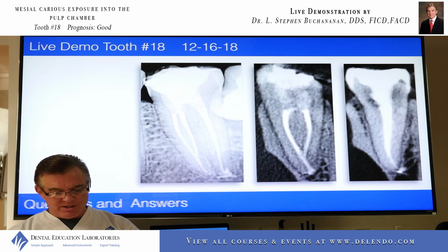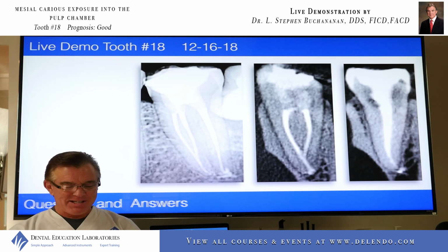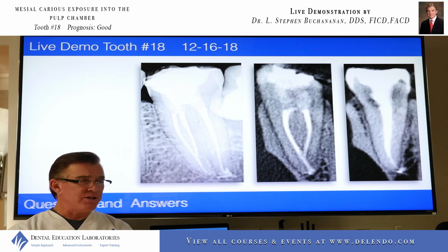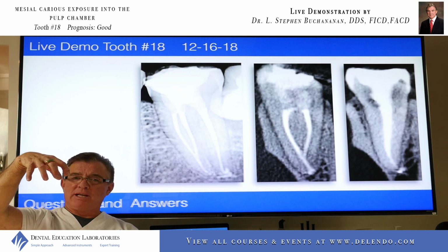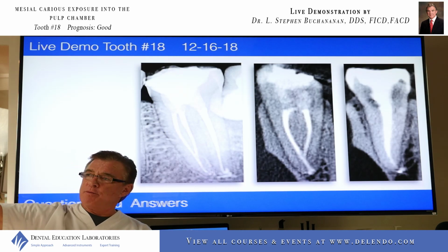What's the microscope system I'm using? Why is everyone wearing 3D glasses, and why is it different from the classic dental operating microscope? The microscope I use is either a MoraVision or a TrueVision heads-up 3D camera system. Basically, it just goes right on top of the microscope body. It replaces the oculars, so I don't have oculars to look at anymore. I'm looking up at the screen.